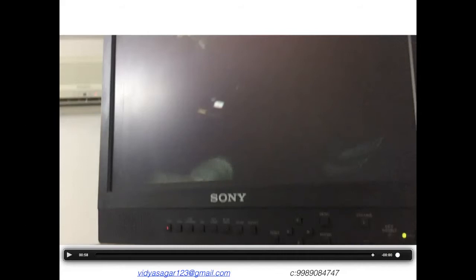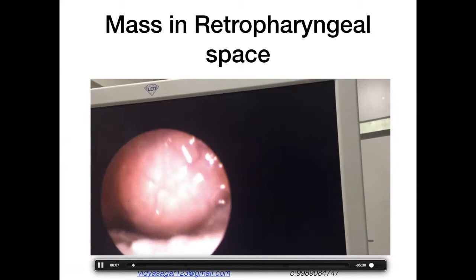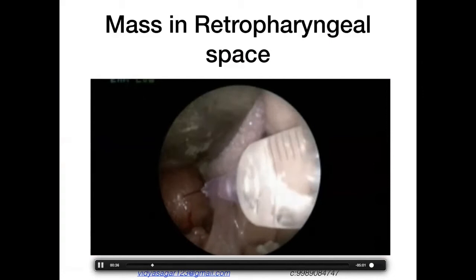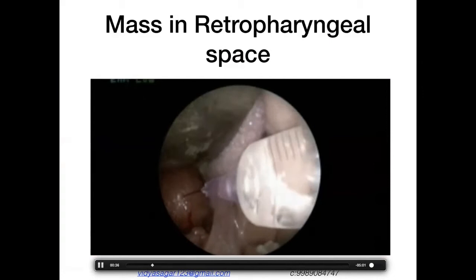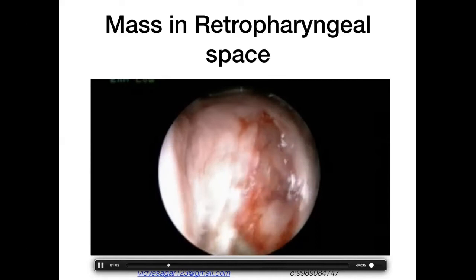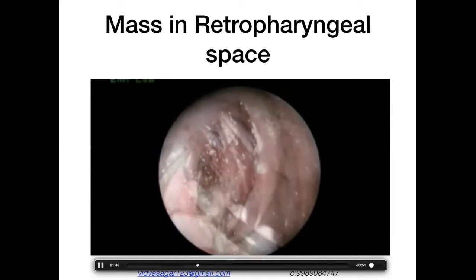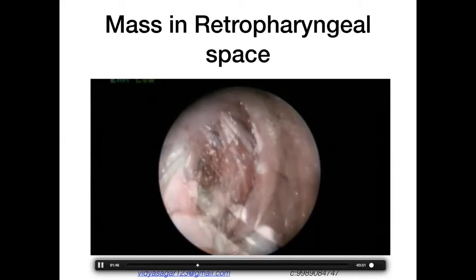The last case in this section: a retropharyngeal mass pushing the epiglottis down and presenting into the oropharynx. We attempted trans-oral endoscopic excision using the coblator and bipolar. The coblator was used as a surface coagulant to coagulate small capillaries over the lesion — a capsulated lesion — and we inserted artery forceps to get into a good plane.